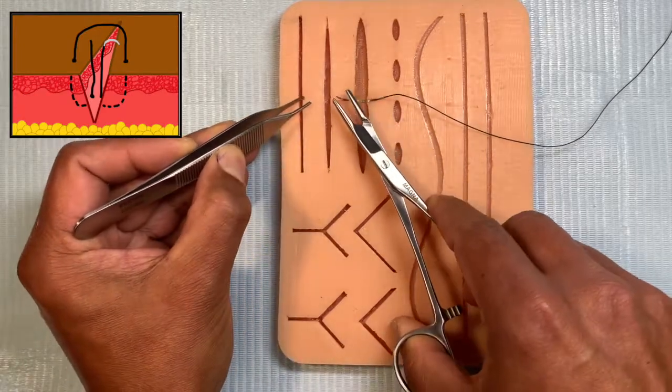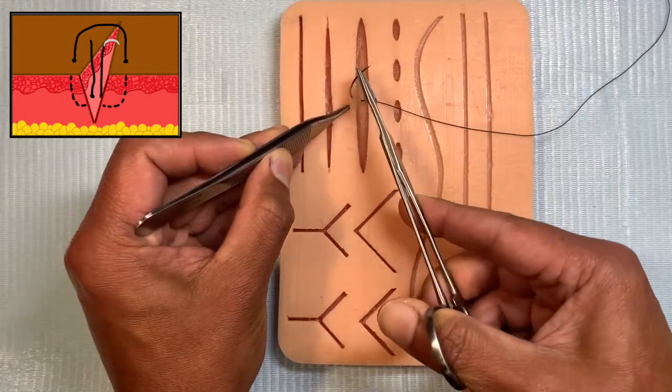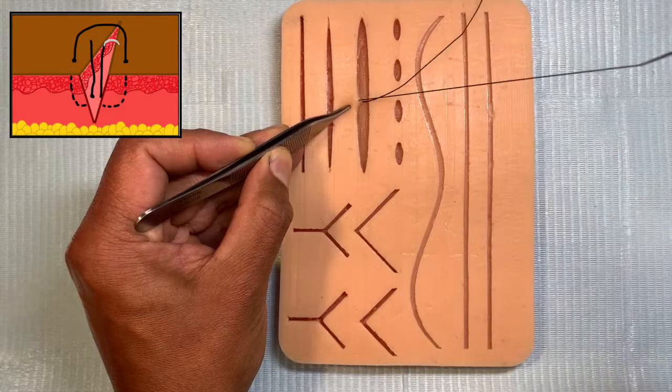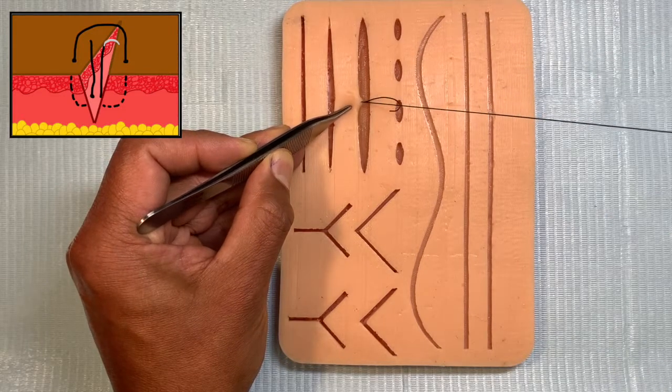Now the surface should be coming to the deeper dermis, not to the very top place of the dermis. So that's my first bite. So that's my D to S.